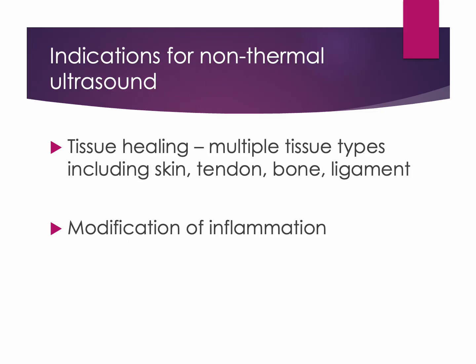Non-thermal pulsed ultrasound is primarily indicated when the goal is to promote tissue healing while minimizing tissue heating. It is most commonly used during acute or subacute stages of injury, such as ligament sprains, muscle strains, tendinopathies, bursitis, and wound healing situations where excessive heat may aggravate symptoms. The proposed benefits are related to non-thermal mechanisms, including acoustic streaming and stable cavitation, which may influence cellular activity, membrane permeability, and tissue repair processes. Clinically, pulsed ultrasound is generally selected when the therapist wants healing-oriented effects rather than increased tissue extensibility or deep heating.